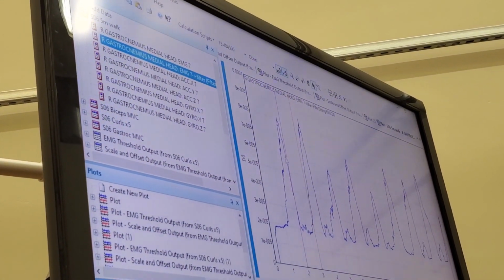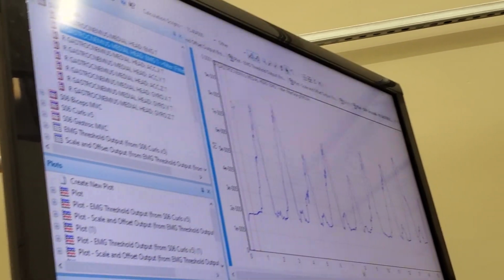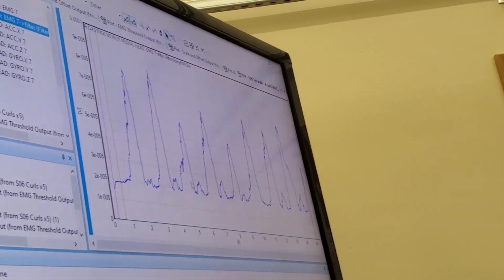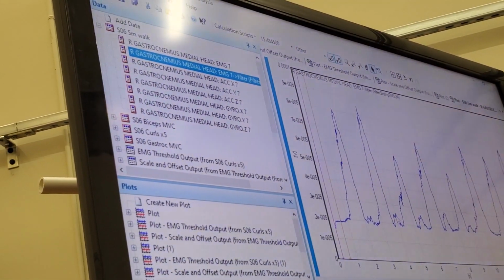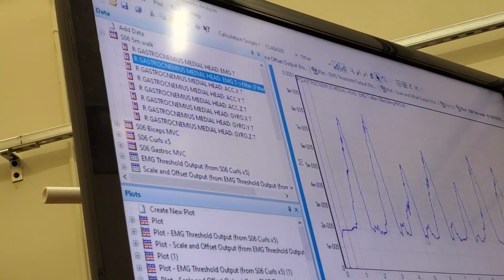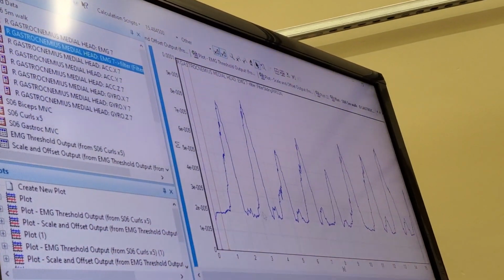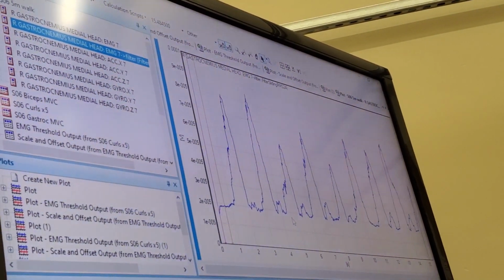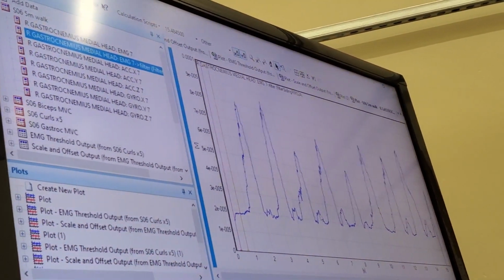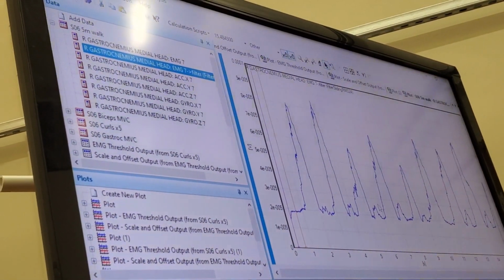Yeah, so this is our 5-meter walk. I think this is going to be a little bit more interesting to look at, and a better indication of how we can tailor some of the settings to actually get activation windows, because we have these little minor spikes here, which are likely nothing, or maybe some crosstalk due to the electrode placement.